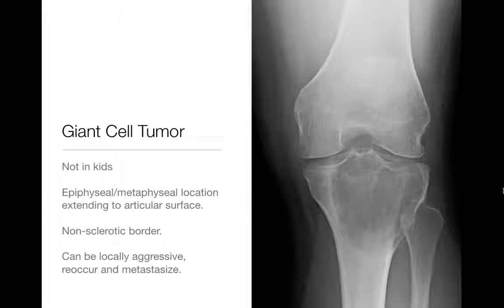Next up, giant cell tumors. These are for the most part benign tumors, though they can be very locally aggressive, can recur, and can actually metastasize — usually to the lung. Those metastases are not going to kill you, but they'll still grow there. Giant cell tumors originate at the epiphyseal-metaphyseal interface and grow to the articular surface. You can see this one: geographic lytic lesion, narrow zone of transition, non-sclerotic border in the epiphysis and metaphysis extending to the articular surface, without periosteal reaction or fractures.